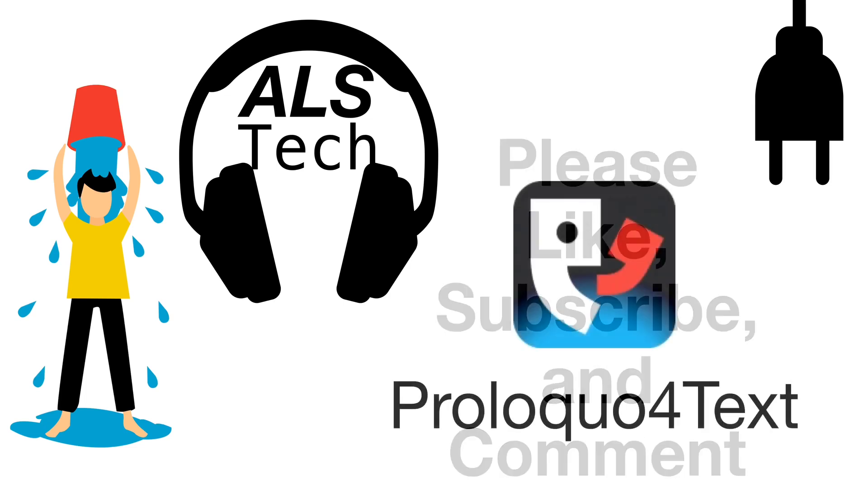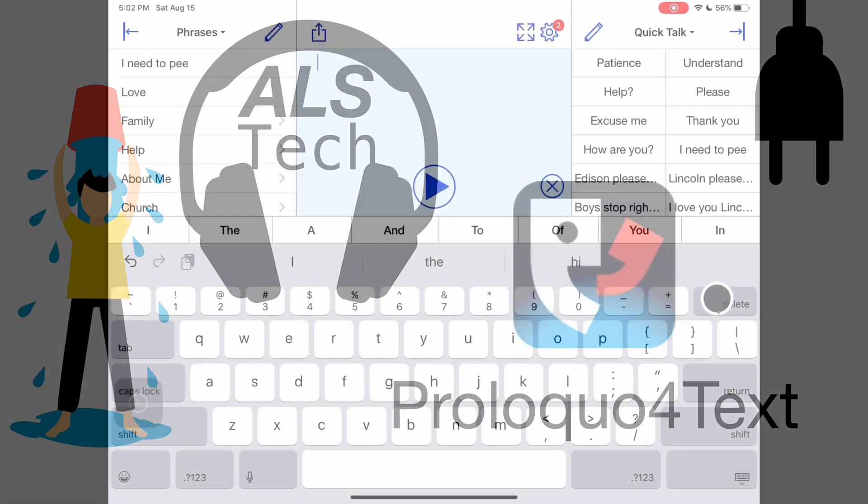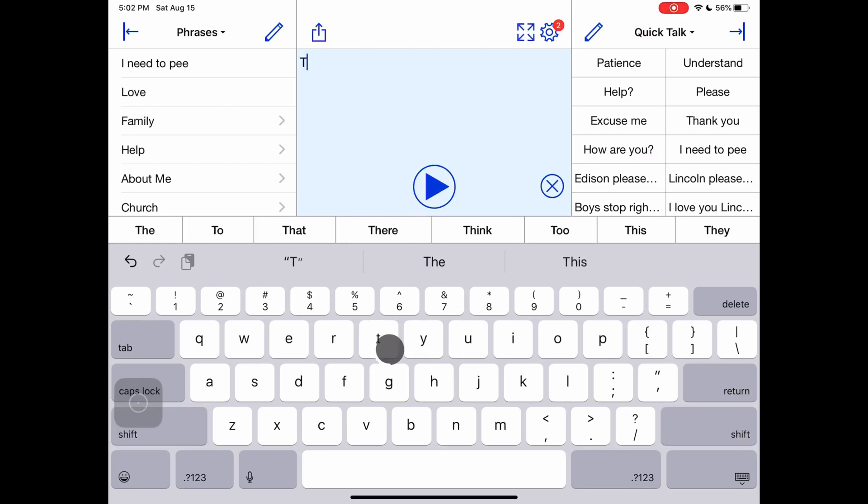Because I can't talk, the Proloquo4Text app is talking for me. That is the perfect segue to talk about talking. Proloquo4Text is an Augmentative and Alternative Communication app or AAC. This is a fancy way to say that it will speak for you.